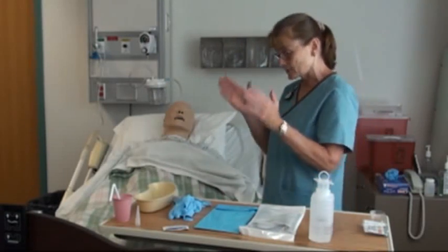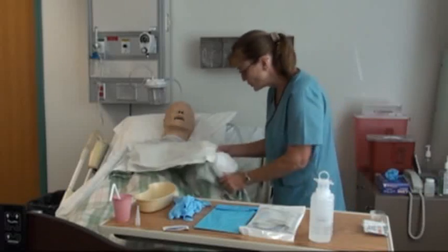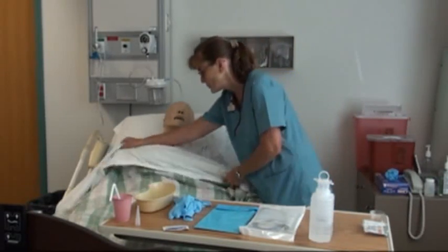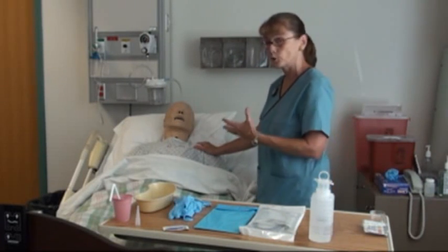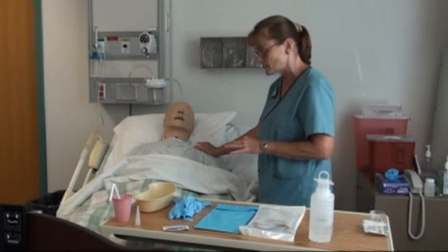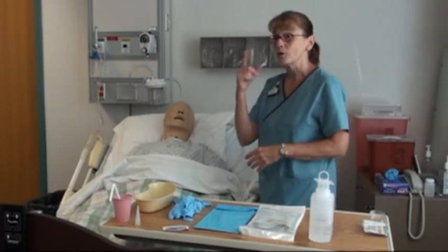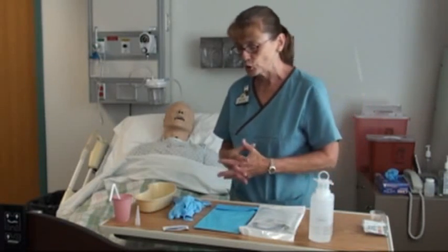Wash your hands, gather equipment, come to the room, introduce yourself, and identify the patient — you certainly wouldn't want to do this on the wrong person. Explain why you're there and what you're going to do, and get verbal consent. Mrs. Johnson has agreed and has no questions. Provide privacy, because this is something you don't want anyone watching done to you.